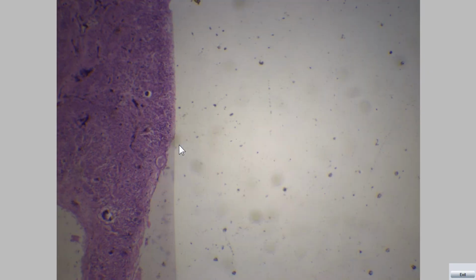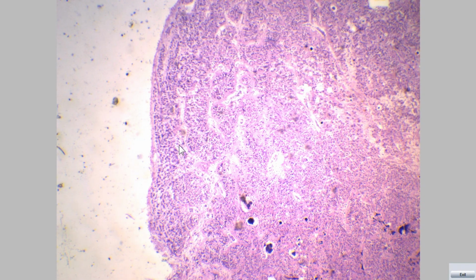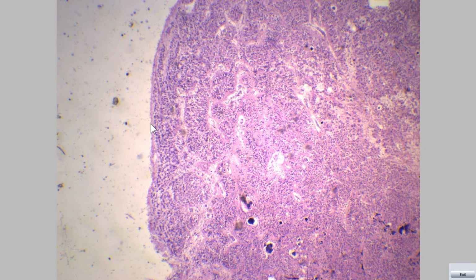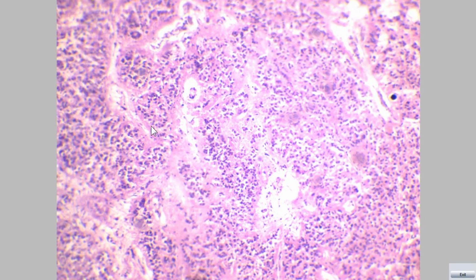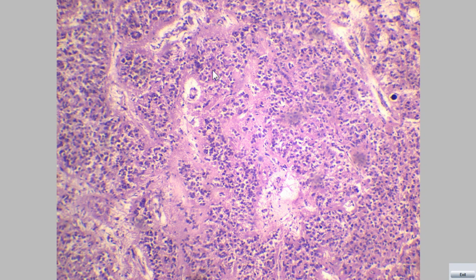The last gland is the pineal gland. Pineal gland is a small pine cone shaped structure. It is covered by connective tissue of the pia mater. The prominent and abundant secretory cells in this organ are called pinealocytes. These are pinealocytes.